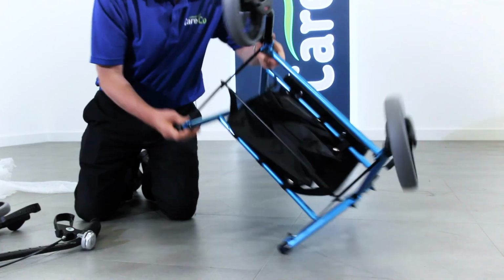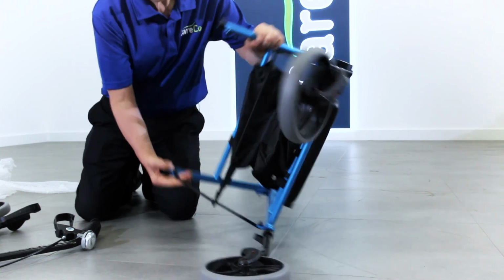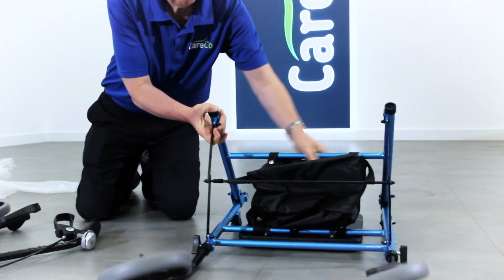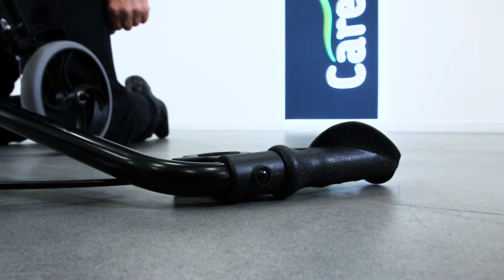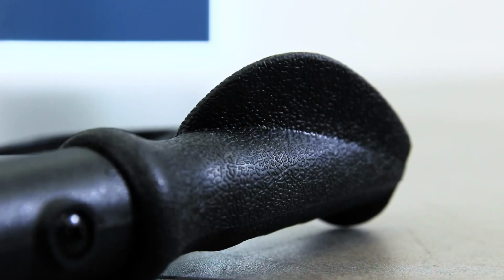The front wheels are connected to the handlebars by the cable brakes, so this is why you must make sure that the front wheels are on the correct side. The palm rests on the handlebars should be facing inwards. This will give you a more comfortable grip when using the product.